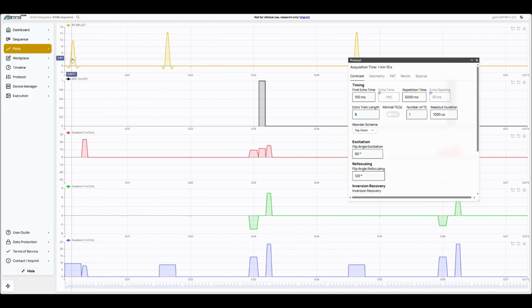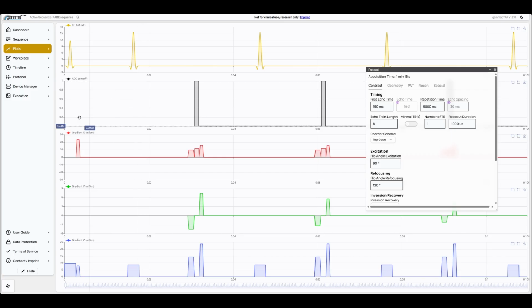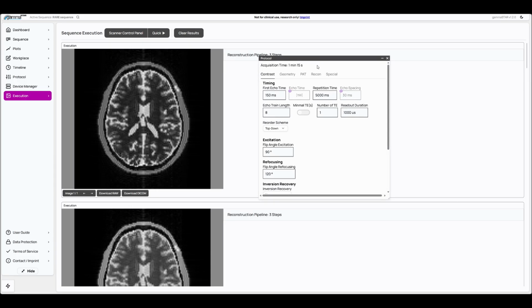So the excitation occurs here, first data measurement occurs here. In between we have the refocusing pulse. That means from here to here already quite some amount of signal decayed, and depending on the type of tissue, for example for the ventricles with the fluids, not much signal decayed, but for the gray and white matter regions, much signal decayed, so we get some weighting based on the T2 times in our images.